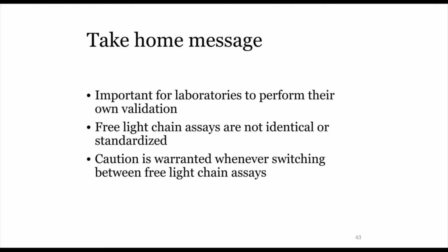I would like to end this presentation with some short take-home messages based on our experience comparing the two free light chain assays. It is very important for laboratories to perform their own validation using clinical specimens prior to implementing a new free light chain assay. Also, free light chain assays as of present are not identical to each other, nor are they standardized. We believe that caution is warranted whenever a laboratory is considering a switch between free light chain assays.